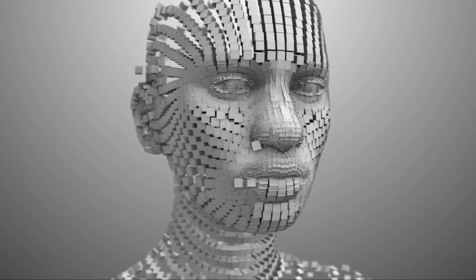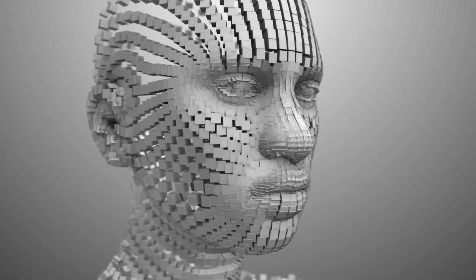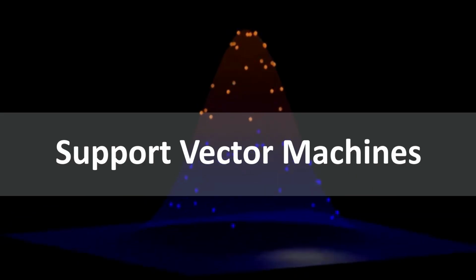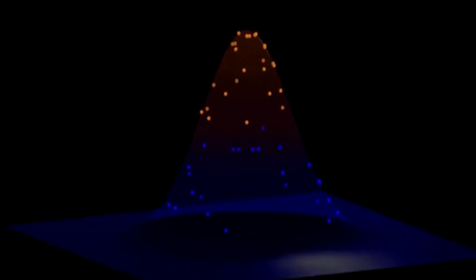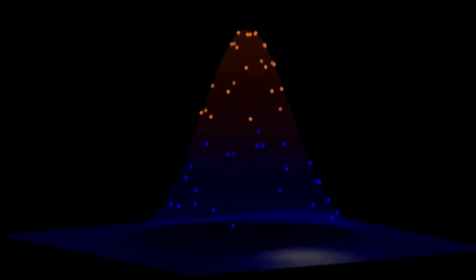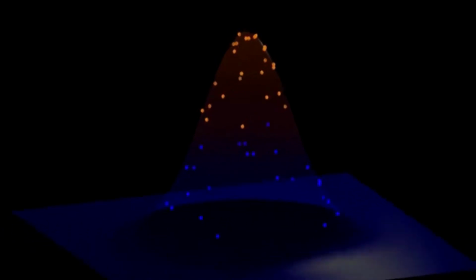We have used support vector machines and multi-layer perceptron for heartbeat classification. SVM is a supervised machine learning algorithm which can be used for classification or regression problems. It uses a technique called the kernel trick to transform the data, and then based on these transformations it finds an optimal boundary between the possible outputs.